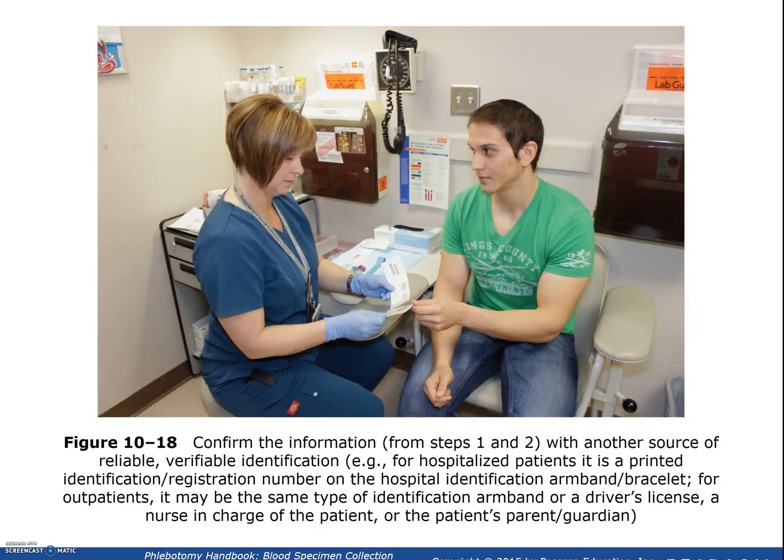We're going to confirm the information from steps 1 and 2 with another source of reliable, verifiable identification. So a hospital patient's printed identification, registration number on the hospital identification armband and bracelet, or for outpatient we might use a driver's license, a nurse in charge of the patient, or the patient's parent or guardian.